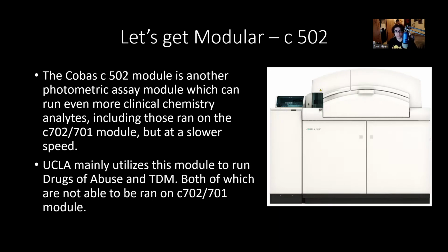And it's also good to isolate those two, because those two categories of tests are very important, especially if it's involved in a DUI case or something. It can get very serious, and it's good to isolate those tests on one module, as opposed to mixing it up with all the other general chemistry testing.